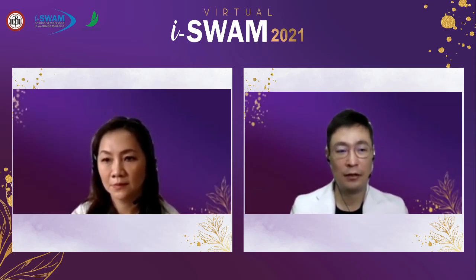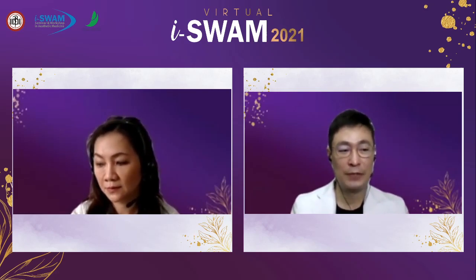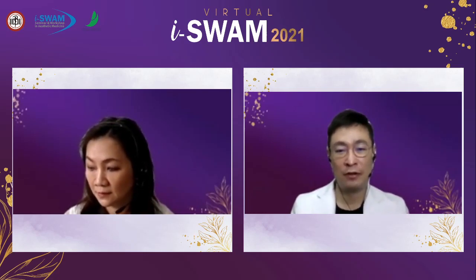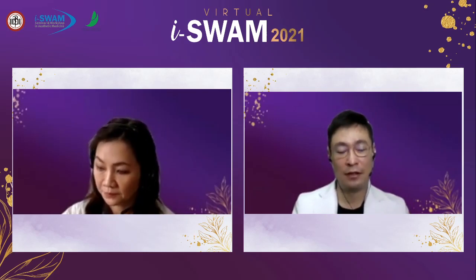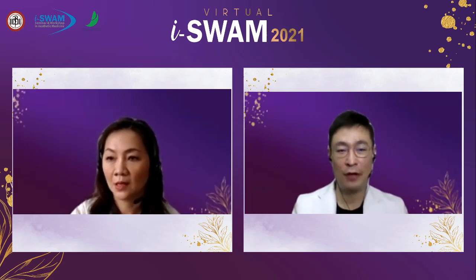So if you want to be sure that the effect will last longer, then use high quality products like Croquis. So put more threads than usual, or select high quality PDO threads.